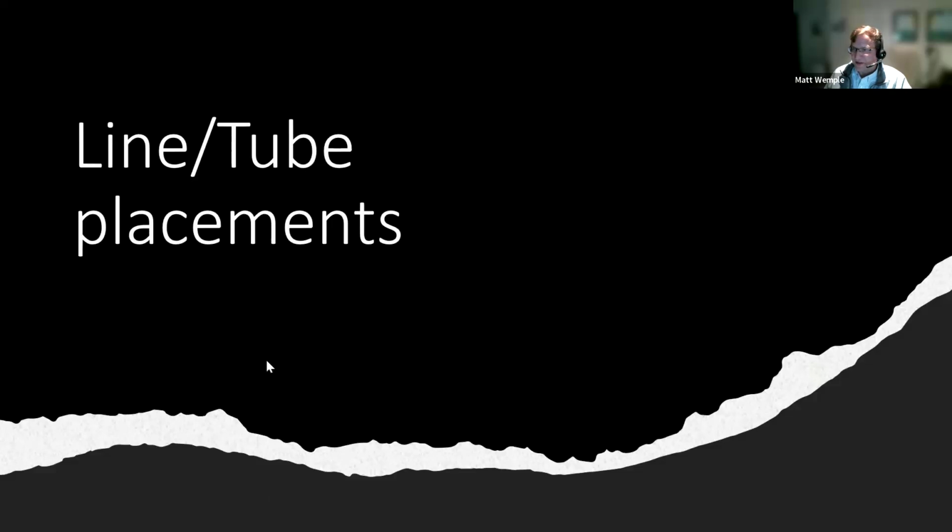All right, now let's talk about lines and tube placements. Any questions so far? Or if you put some in the chat, maybe I can circle back to them after one or two of these examples.